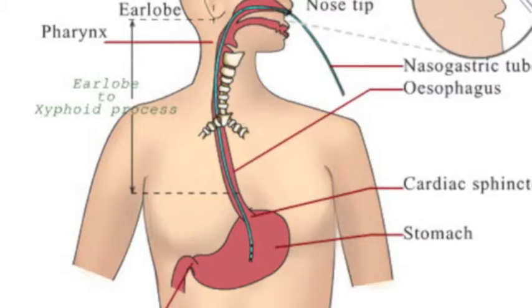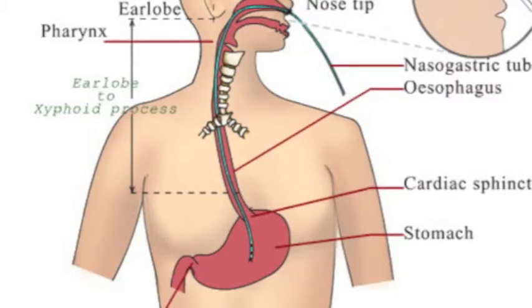Okay. The different tubes come in various sizes, different from IV. The smaller the number, the smaller the diameter. This is like a 16 or 18, but there are smaller ones, which you would use for kids.